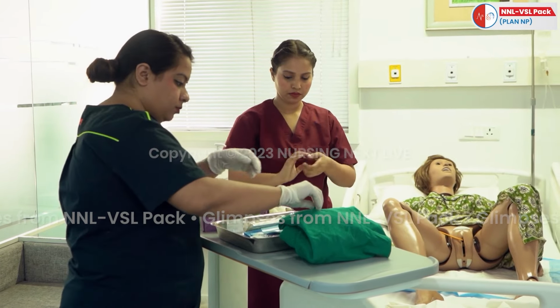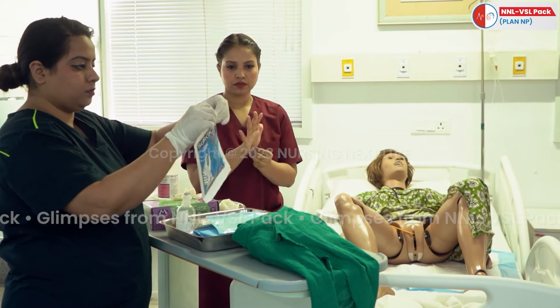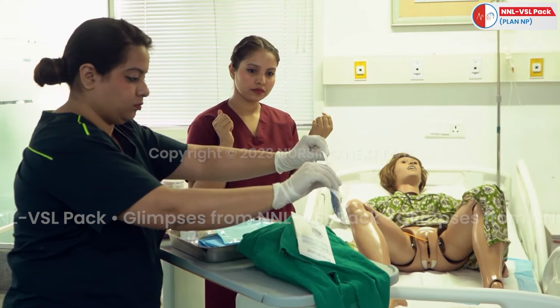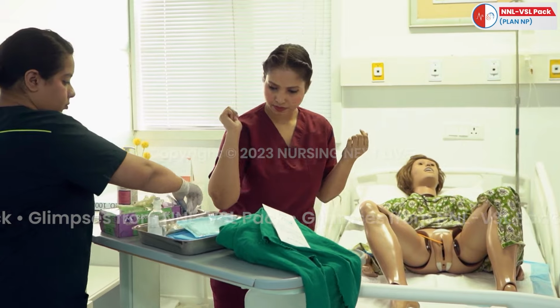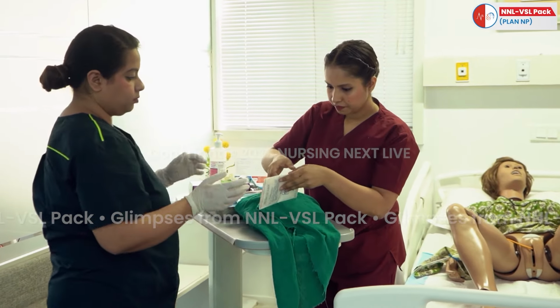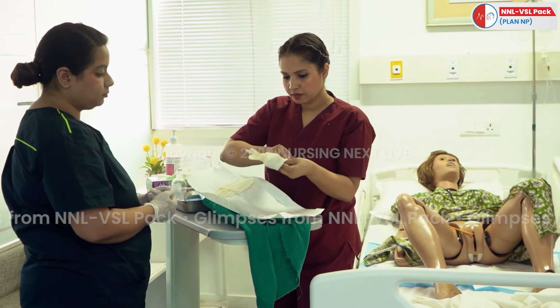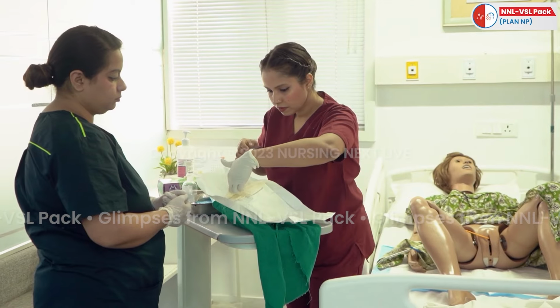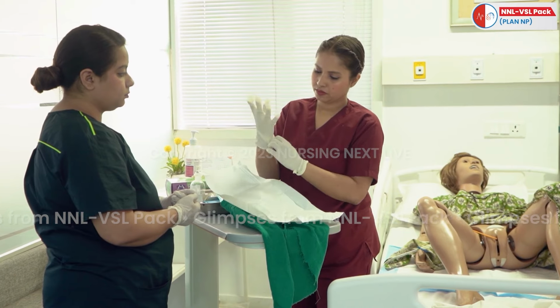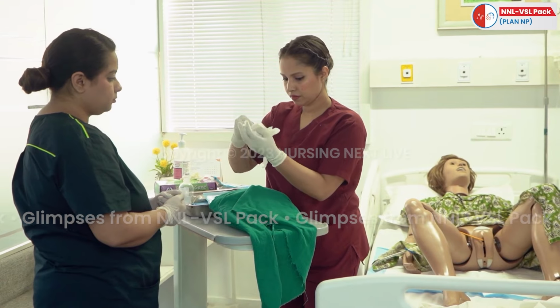Assistant nurse will remove the first flap of sterile tray and put sterile gloves. Assigned nurse will open the other flap and fill normal saline in the bowl.